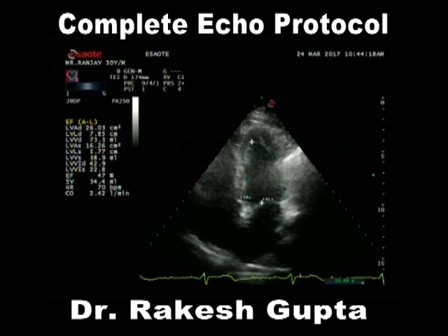At your level, take my words, take our words, take Prashar sir's fatherly advice: always calculate ejection fraction, don't depend on eyeballing. Hey, it's normal, it's not that. Once you keep on spending time and think how much the ejection fraction is, and then trace the ejection fraction, that will help you in coming to a conclusion over a period of time when you become expert at eyeballing ejection fractions.